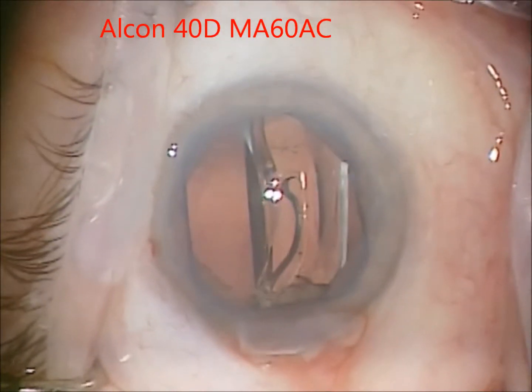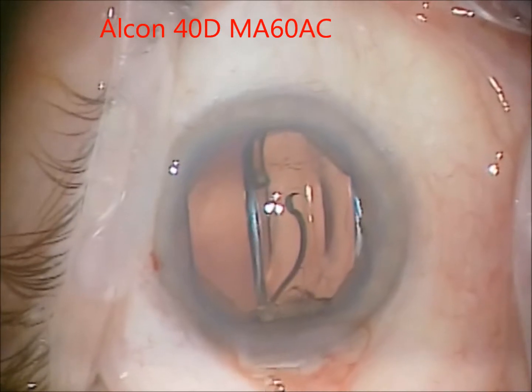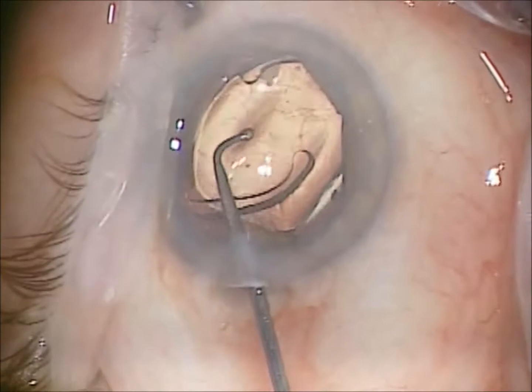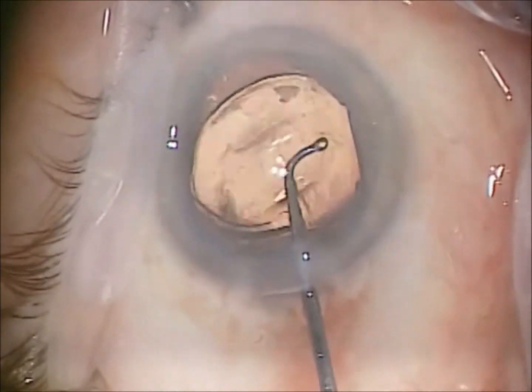Now I'm inserting a 40-diopter Alcon MA60AC lens. This is the highest power available in the U.S. today. I did tell the patient that she could go out of the country for a lens that would fully correct her hyperopia, but she could not afford to do this.